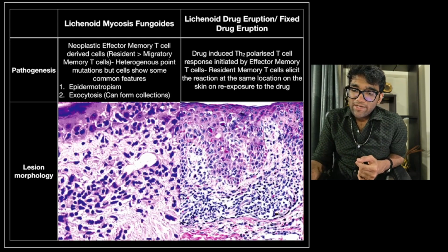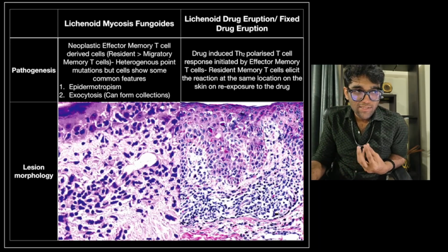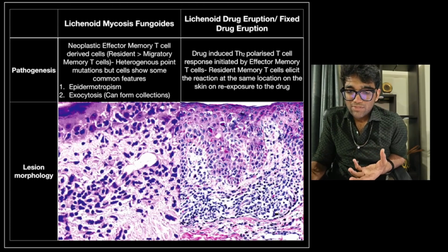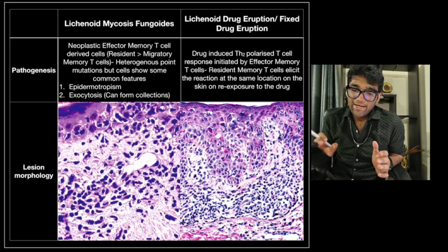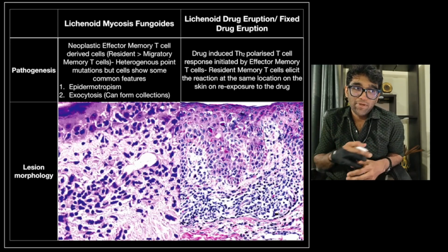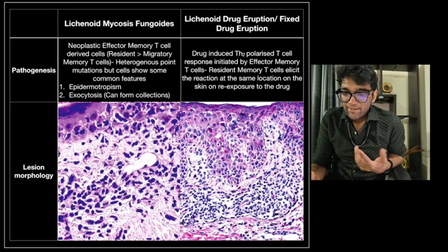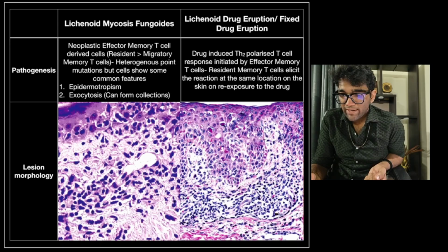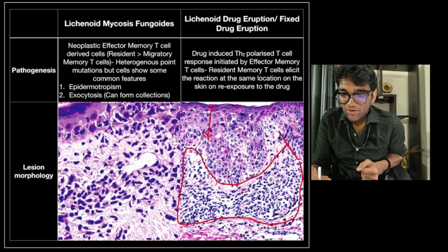Now, on the other hand, in lichenoid drug eruption, what we found earlier was a relatively not very well demarcated lesion, with the center of the lesion showing slight erythema and the surrounding areas showing slightly brownish to violaceous discoloration, indicating that the lesion at the sides is actually extending deeper than you would expect. Correspondingly, in the histopathological section, you find a dense lichenoid infiltrate. Again, this is not lichenification because the epidermis is not lichenified.